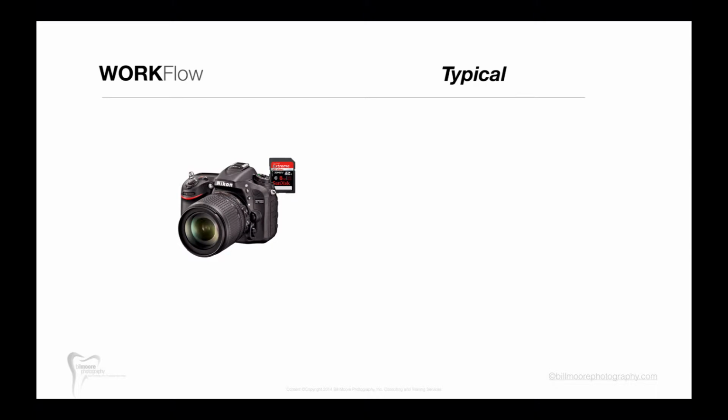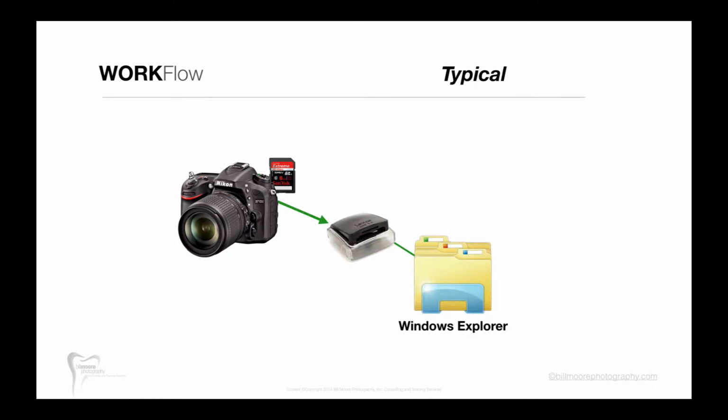What I found that dentists typically do when they implement intraoral photography in their office looks something like this. They capture the images on a DSLR camera, take the memory card out of the camera, put it in a card reader, and download their images to their computer and manage the images in a program like Windows Explorer that comes with the computer. Well, that seems pretty easy, but it tends to get a bit more complicated than that.